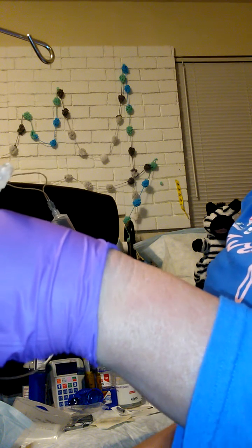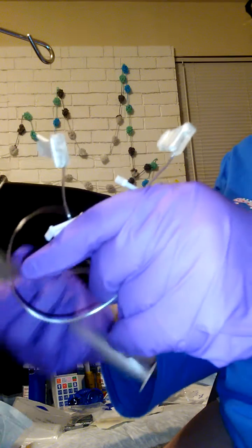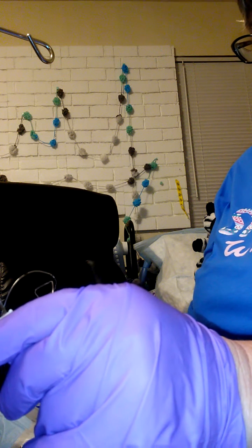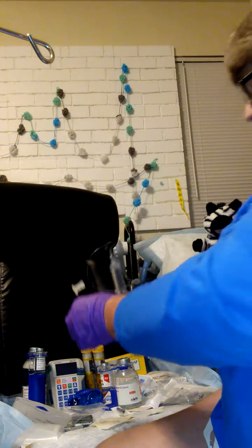The important thing is not to get it all the way to the end of the needle. And it's not going to be able to do that because I do have it locked right here. So it's not going to go all the way there. Every now and then you'll get one that does not follow protocol. It does leak through for some very strange reason. But I've got that going. And now I'm going to, yeah, there I can see it moving. Okay, I'm going to secure that right here. It's not going anywhere. It's on lockdown.